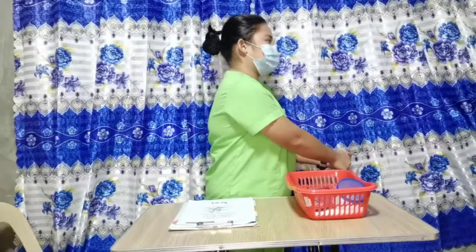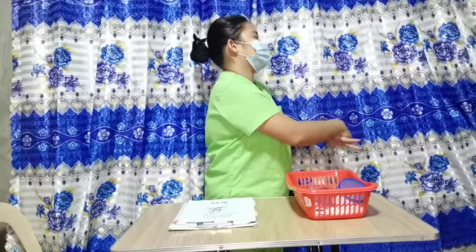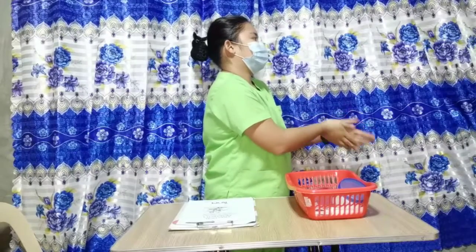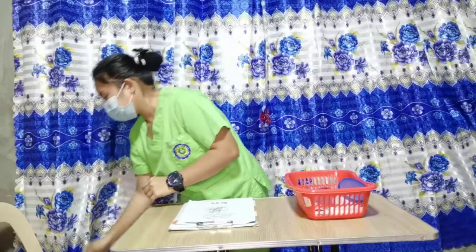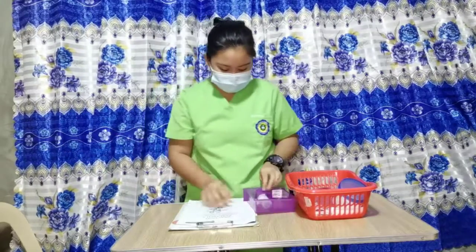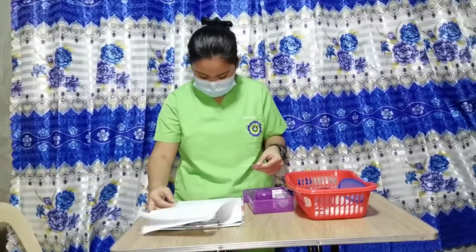Perform hand hygiene. Move the medication cart to the outside of the patient's room or prepare for administration in the medication area. Prepare medication for one patient at a time. Read the MAR and select the proper medication from the patient's medication drawer or unit stock.